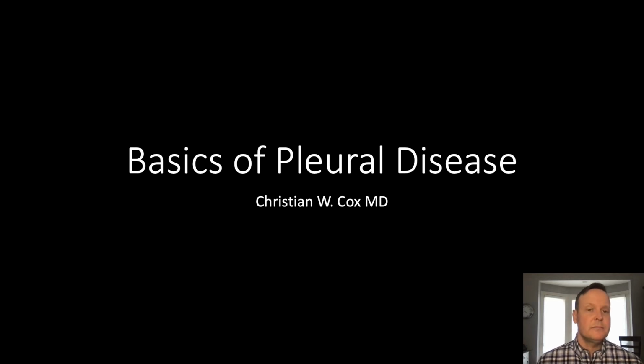Hi, Chris Cox again, thoracic radiologist at Creighton University, and I'm going to be walking you through basics of pleural disease. This will be focusing on CT with some mention of radiograph imaging.